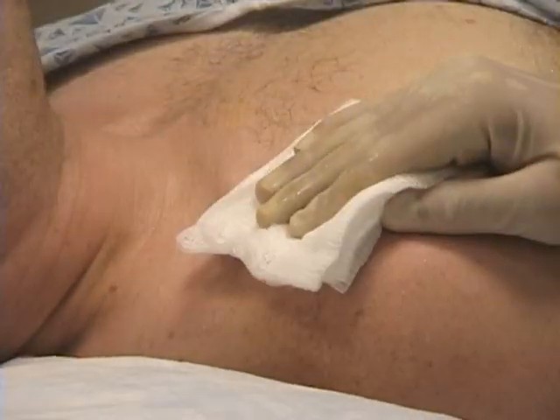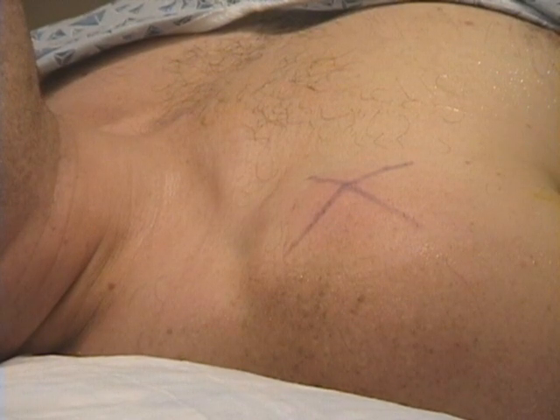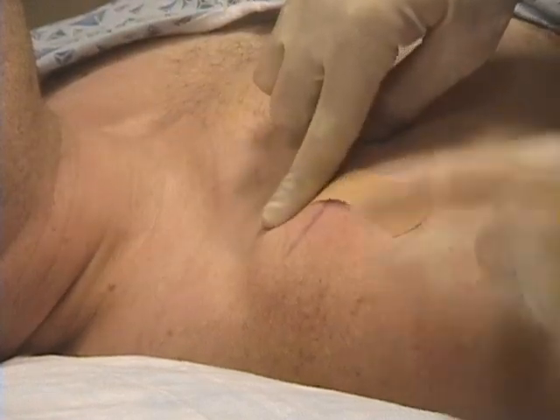Now you are complete. You can remove the needle, apply pressure, and place a sterile bandage.